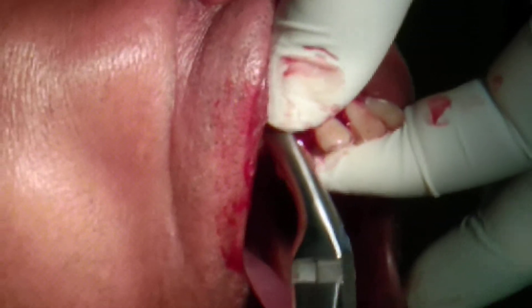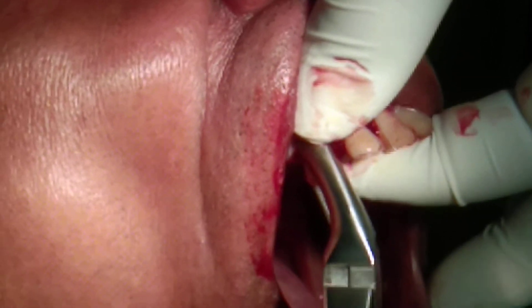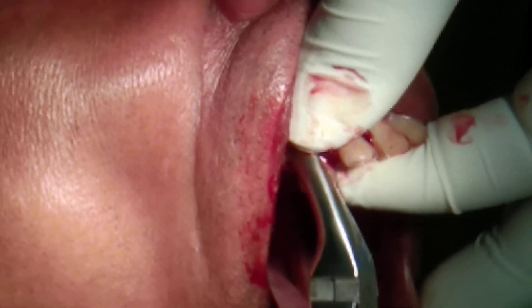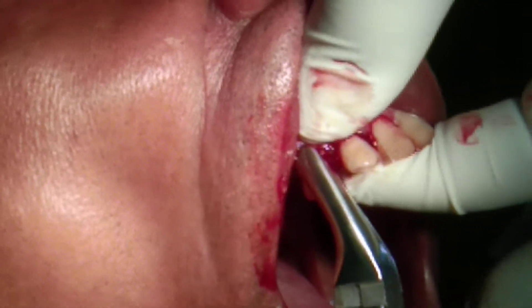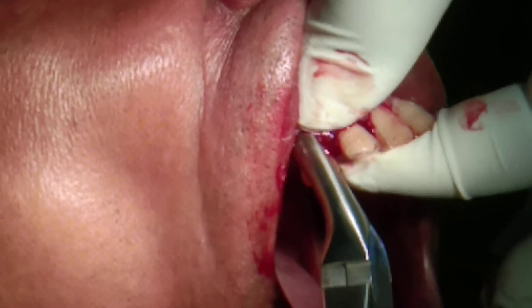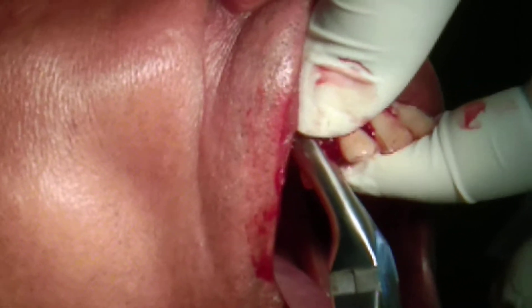Now every single-rooted tooth — you always try to go for a figure-eight motion. This is going to tear apart all the periodontal ligaments. And after that you slowly exert pressure on the buccal side.